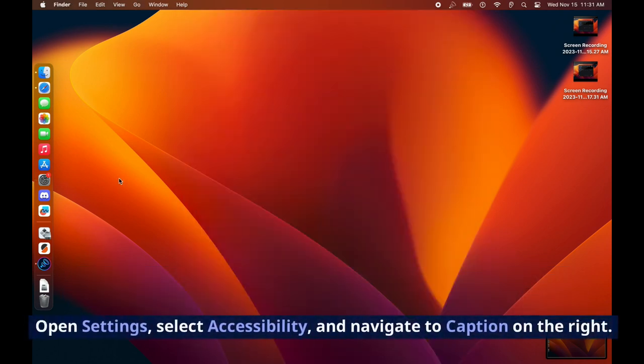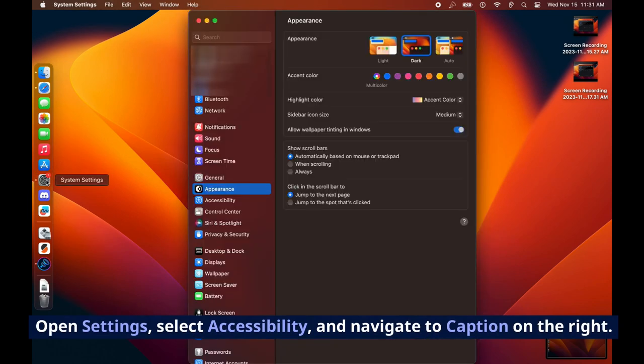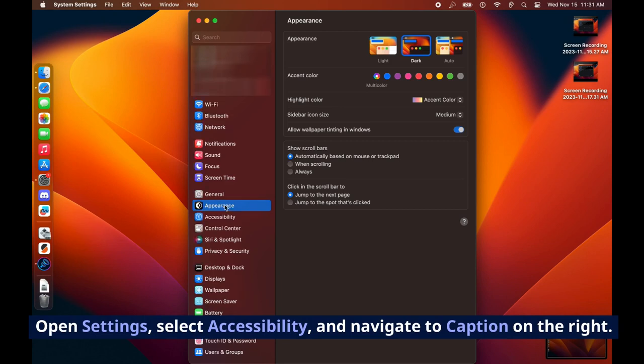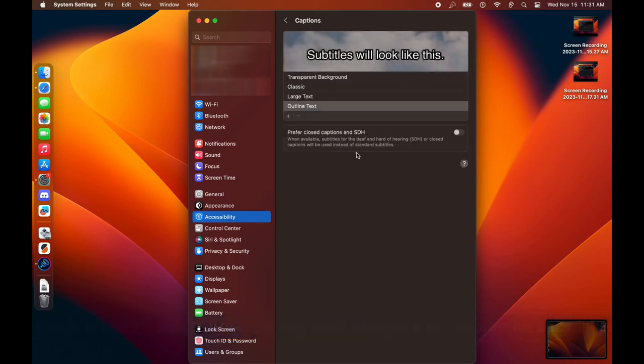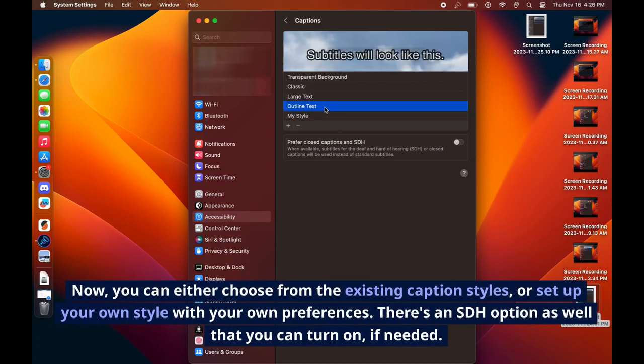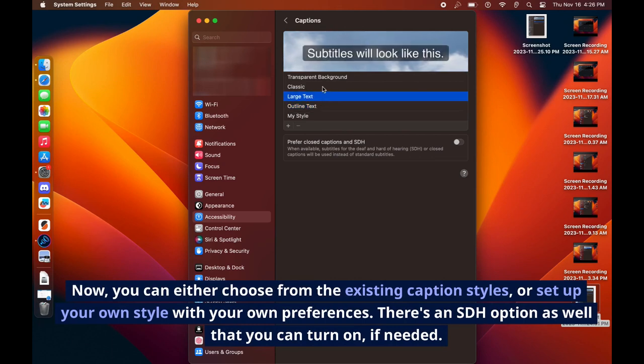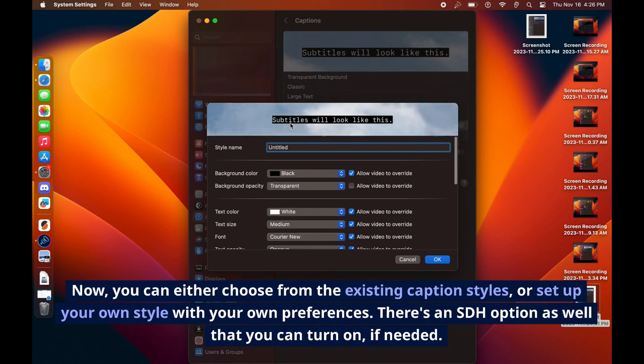Open Settings, select Accessibility, and navigate to Caption on the right. Now you can either choose from the existing caption styles or set up your own style with your own preferences. There's an SDH option as well that you can turn on if needed.